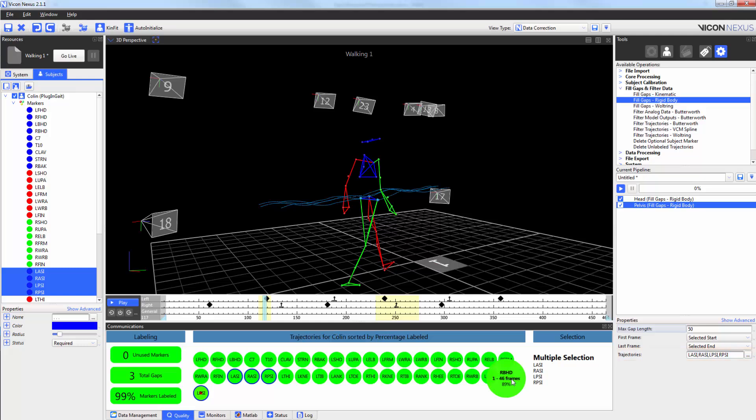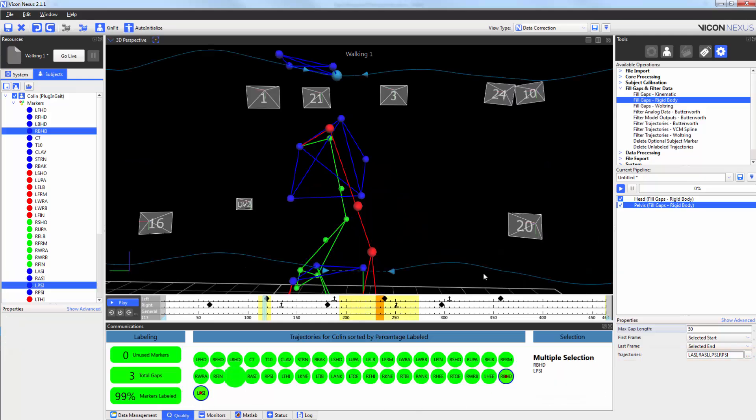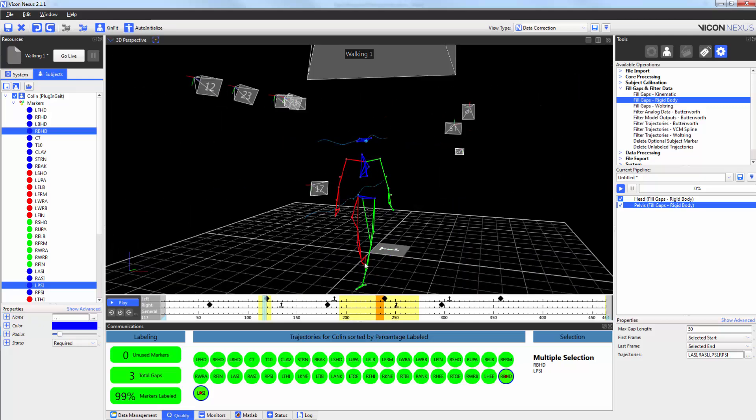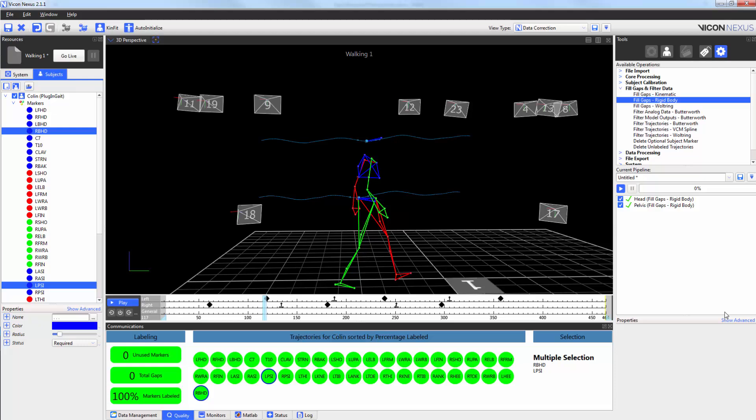Now when I highlight my two markers to see the gaps. When I press play, I now have 100% of my markers labelled.